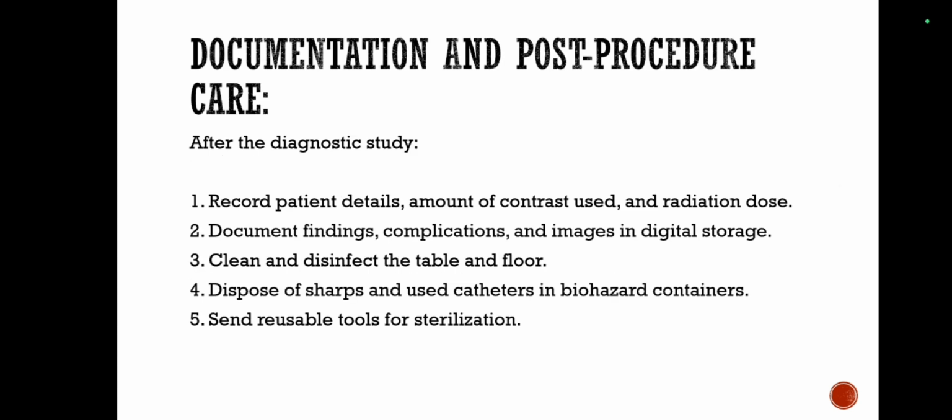After the procedure, we have to record the patient's details, the amount of contrast that we used, and the amount of radiation dose. Then we have to document the findings, complications, and also the images in digital storage. Then we have to clean and disinfect the table and floor once the procedure is done. We have to dispose of sharps and used catheters in biohazard containers, and also send reusable tools for sterilization.